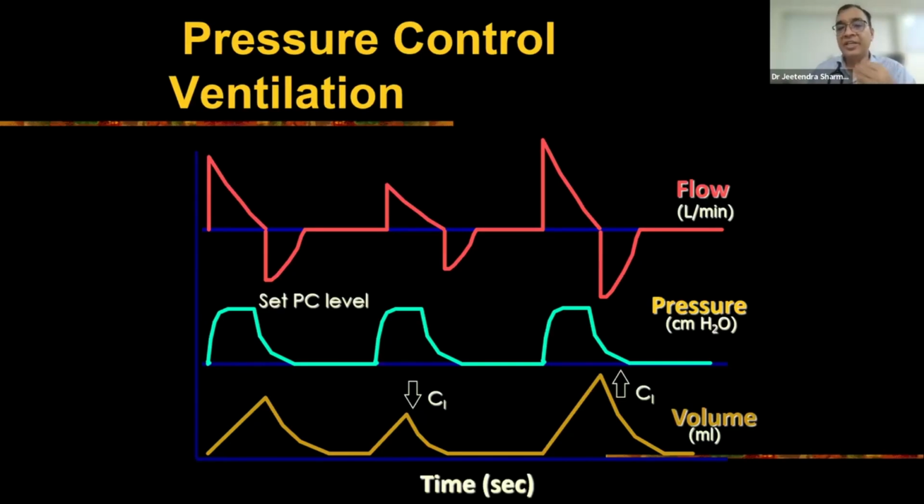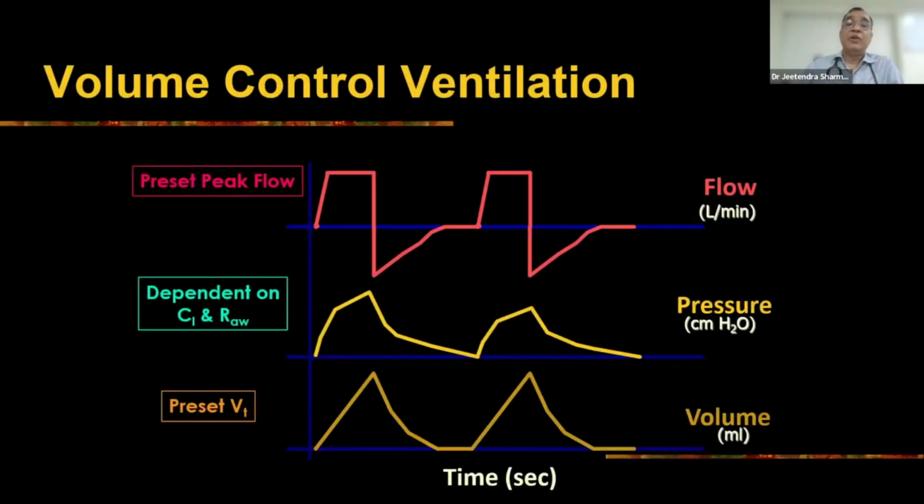So you understood now. Again, repeat, pressure assist control: time or patient trigger, just for the sake of convenience the patient trigger you can convert into flow or pressure. So time or patient trigger, pressure limit, time cycle. Okay. Now volume control.